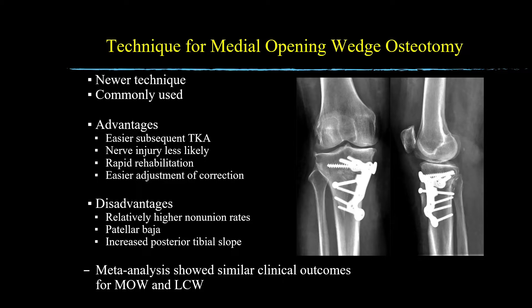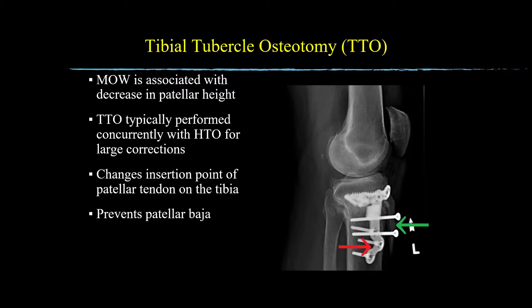Demonstrated on this slide are AP and lateral radiographs of a status post-healed uncomplicated medial opening wedge HTO. Bone graft material at the site of the osteotomy is fully incorporated. The plate and screw fixation securing the osteotomy is intact. An additional anteriorly positioned screw secures a concurrent tibial tubercle osteotomy. The altered anatomy created by a medial opening wedge HTO can result in patellar baja. Due to this, TTO is typically performed concurrently with a medial opening wedge HTO for large corrections.